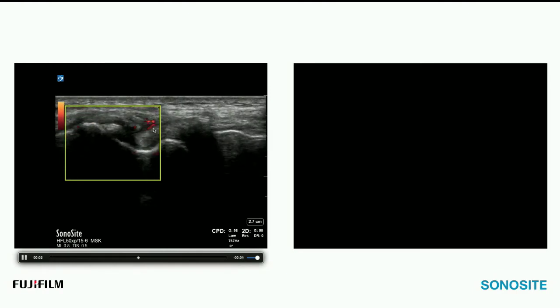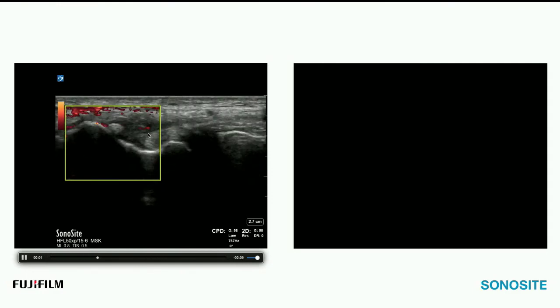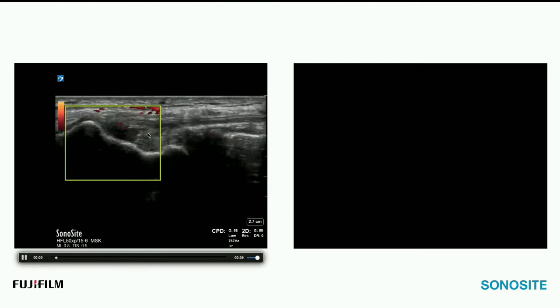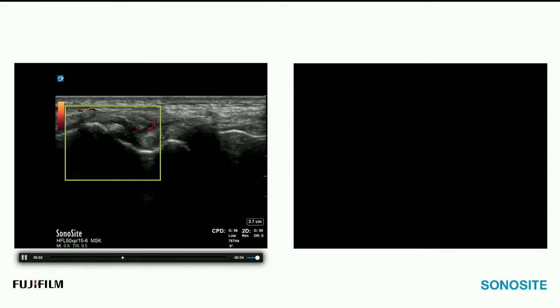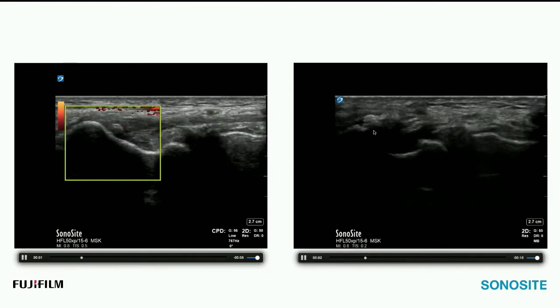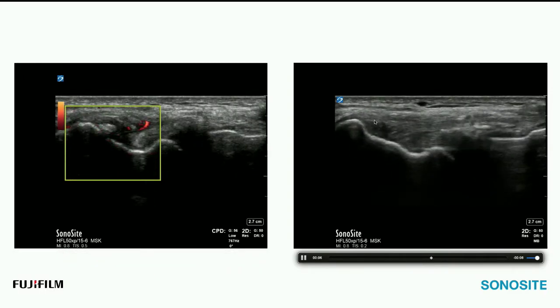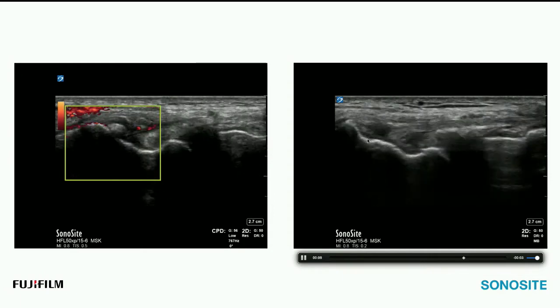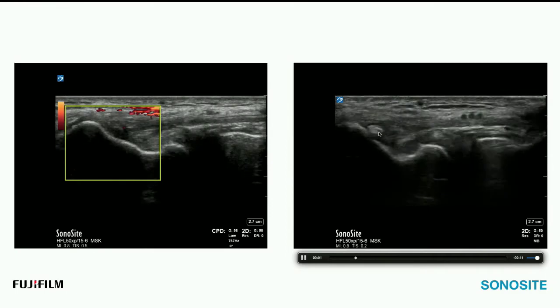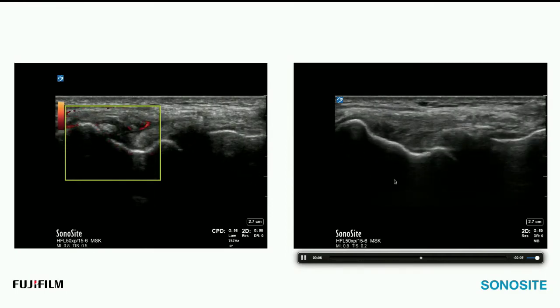But you can see this internal vascularity within the architecture of the ligament that should not be there, and that's why we traditionally set our ultrasound machines to detect low-level flow in the form of vascularity in areas that shouldn't be there. And then just panning through that in grayscale, just looking and appreciating this huge rock formation that's in the ligament. Shouldn't be there. At this point where you see it shadowing, that would show up on a radiograph, for example.